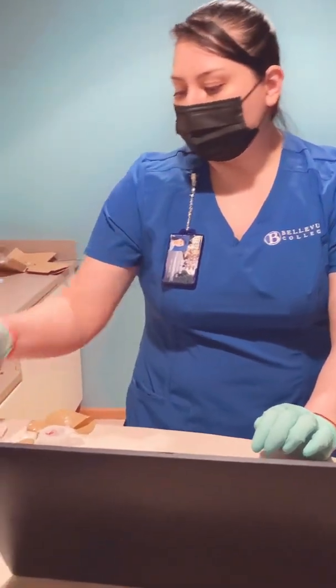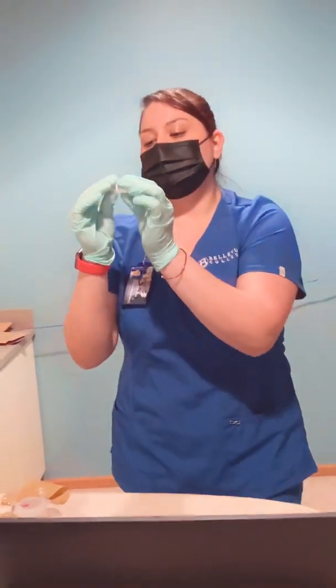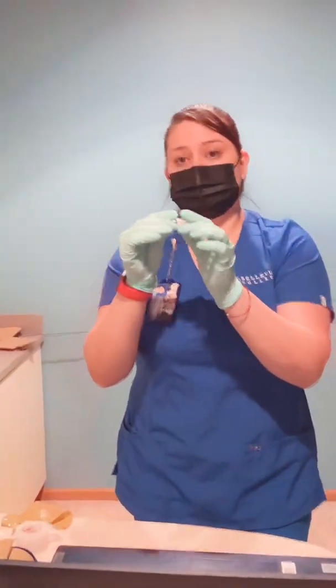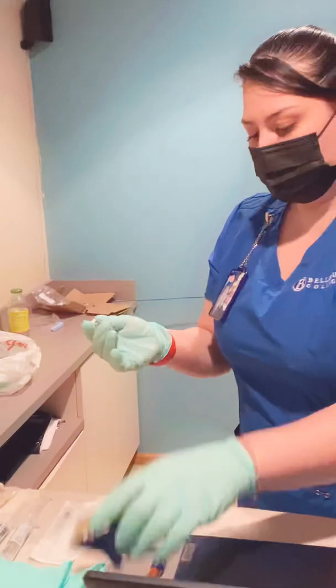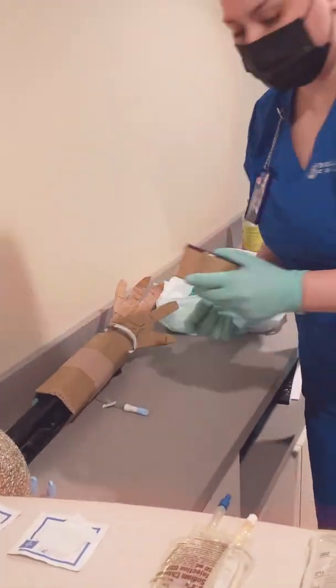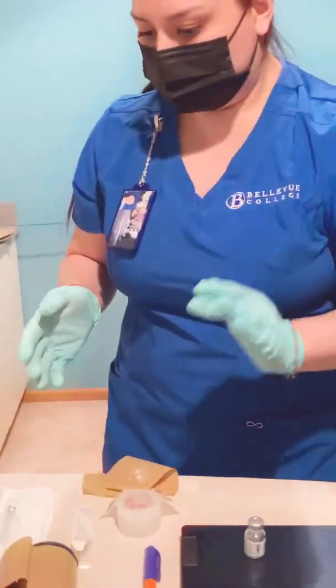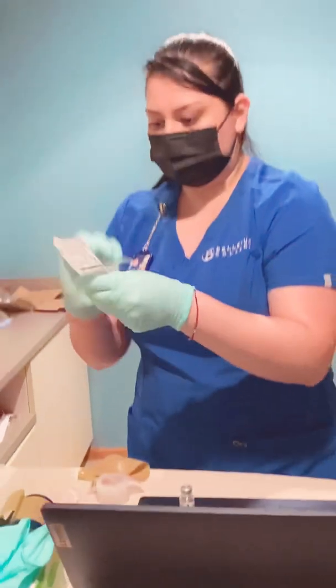So I'm going to grab my medication vial, and it is ondansetron. I'm going to check the color, the clarity, and the expiration date. Looks good. I'm going to scan it into the MAR. I'm going to scan the patient's wristband. Okay, and now I'm ready to prepare my medication.